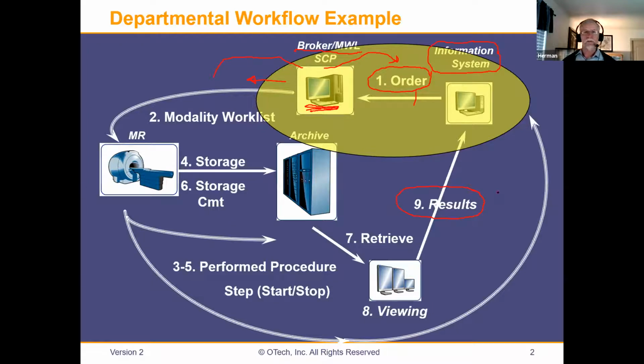I don't see a lot of problems occurring there. Basically, they know where to find the information, the text in the ORU, and map it in a simple text report. Then we can archive it on the PACS system. So we're going to focus on the beginning part, orders to DICOM worklist mapping.